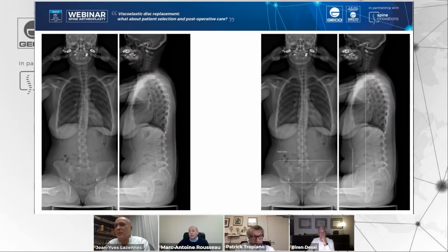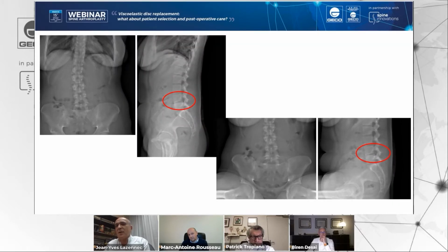Sitting position, because I always do sitting EOS as a research, but I think it is also very interesting to see the evolution of the patient and to understand some particularities. So she is not imbalanced sitting. What we can observe when comparing standing and sitting is the disc is very stiff and very narrow in the anterior point of the disc space.